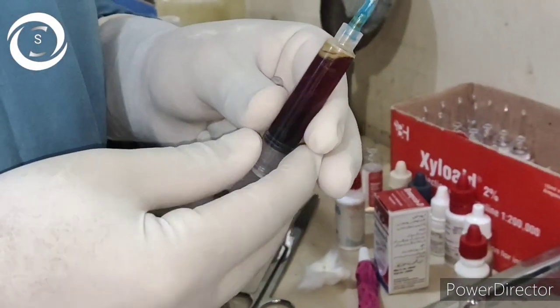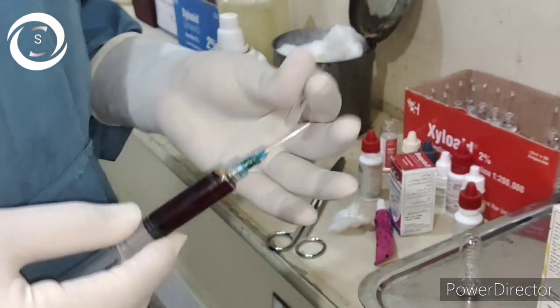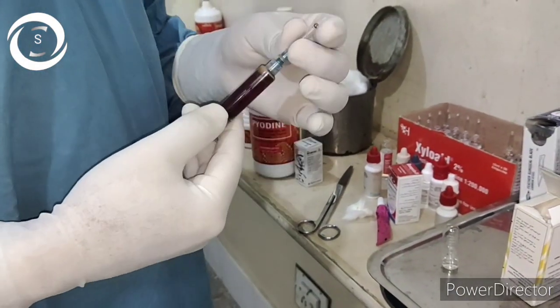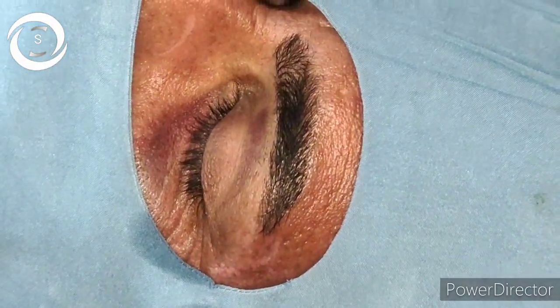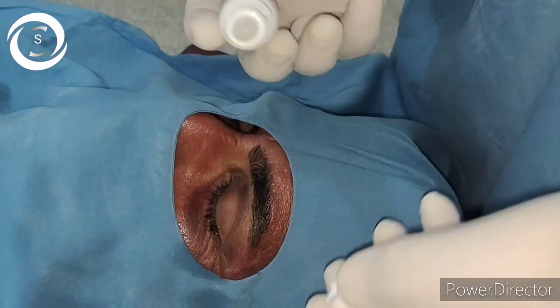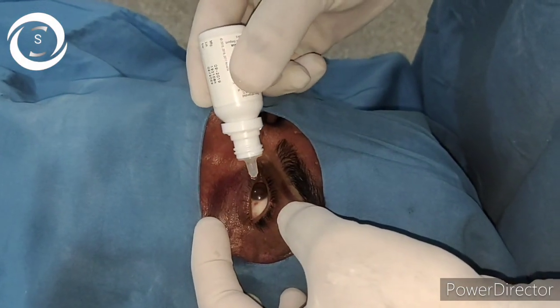And studies have also proved that outbreaks of endophthalmitis were more associated with pharmacological compounding procedures used to prepare the syringes containing the drugs rather than the drug or injection technique. Now it can be performed with or without eyelid speculum.